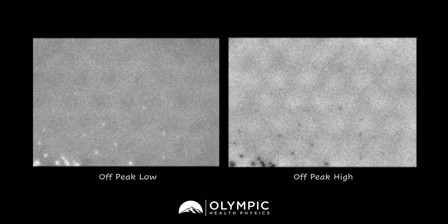With the off-peak low and off-peak high images, we're able to shift the energy window down 10% to center on 126 keV and also shift it up 10% to image on 154 keV, instead of the traditional 140 keV that we would image for tech. In the off-peak high images, you can see some of the PM tubes within the image — that's normal. It's all of the gross non-uniformities that are really indicating that this crystal has been hydrated.